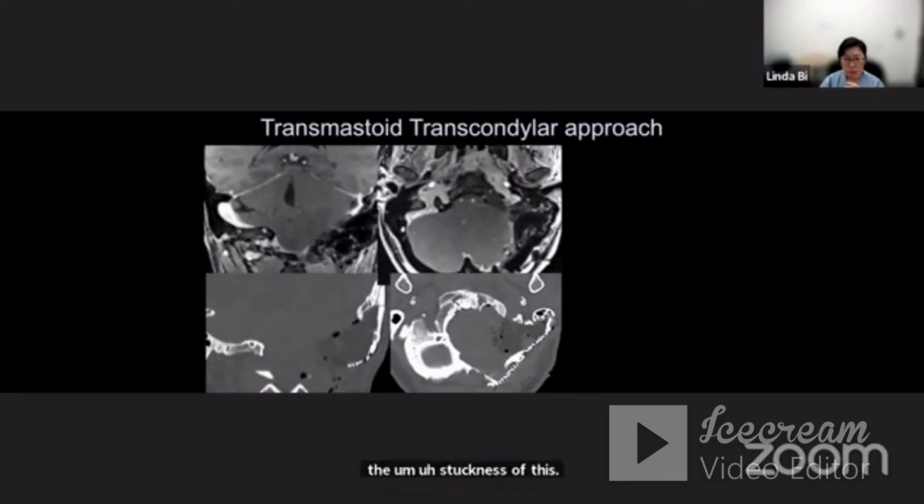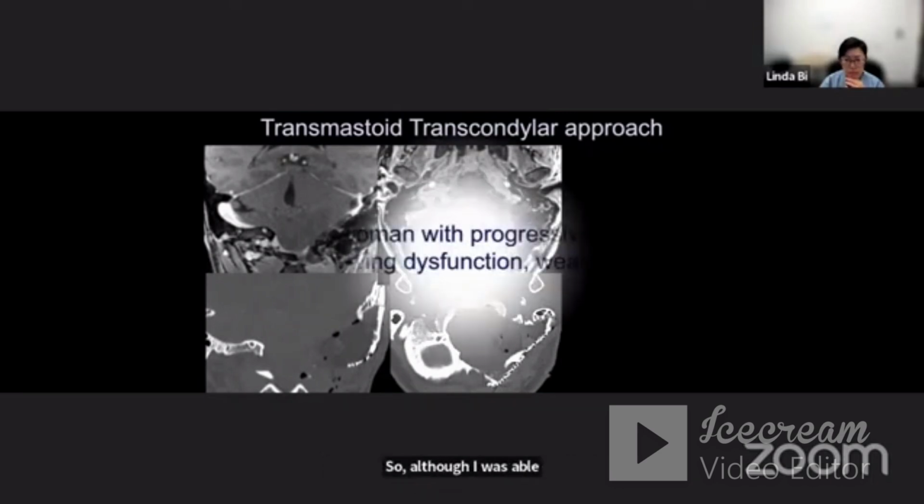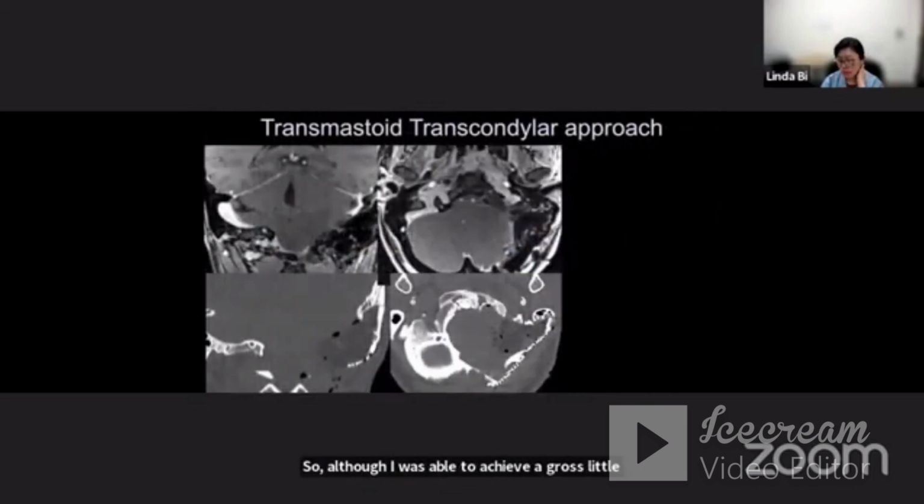And early post-op, she actually had excellent function, but by 2 weeks, she developed more overt lower cranial nerve deficits, including difficulty turning her tongue to the left, a more hoarse voice, and a partially compensated swallow. So although I was able to achieve a gross total resection in terms of bony and soft tissue landmarks, she does have lower cranial nerve deficits that correspond to both our monitoring responses and the risks of this region.